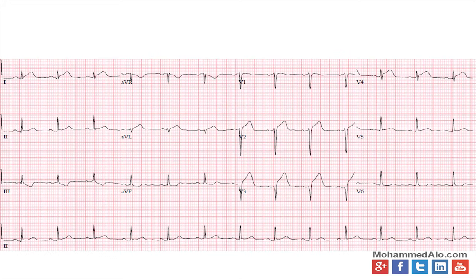Next EKG here. You also got ST elevations, V1, V2, V3, even V1 looks a little weird. V4 has a very low R wave and an abnormal ST segment. This is also an ST elevation anterior MI. It almost looks like the hyperacute waves just now connected with the ST segments and got elevated. If you look at lead 3, you definitely have a reciprocal change. It looks depressed, not exactly the right shape, but pretty depressed. So this is probably acute, and it's probably happening right now.